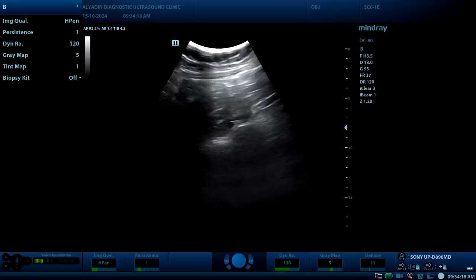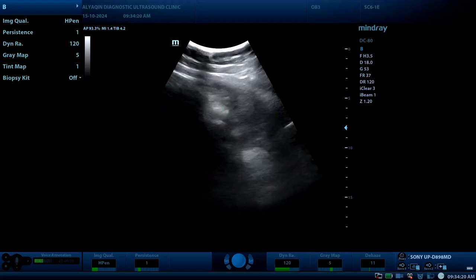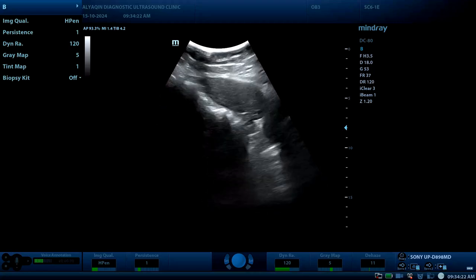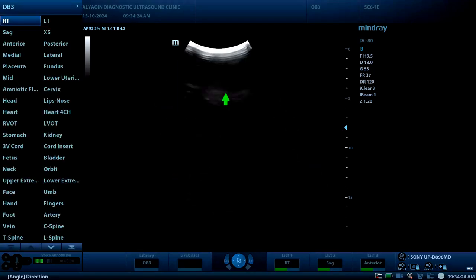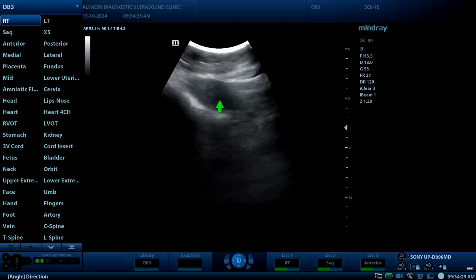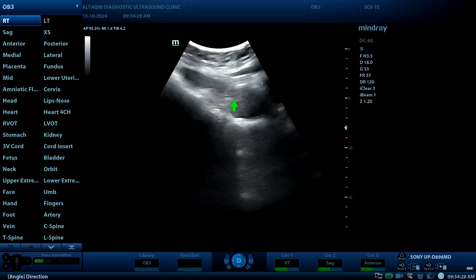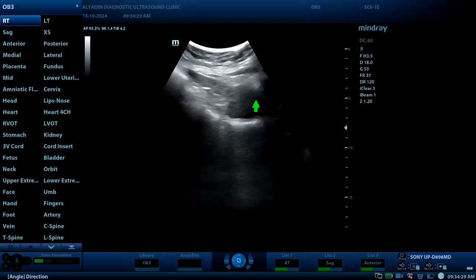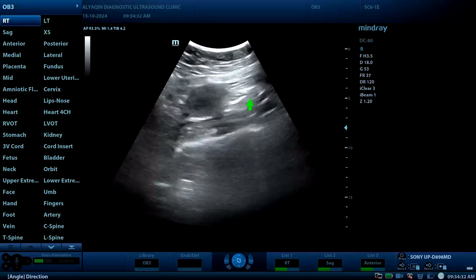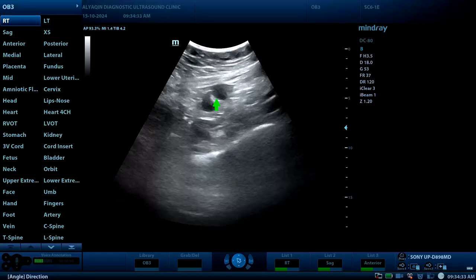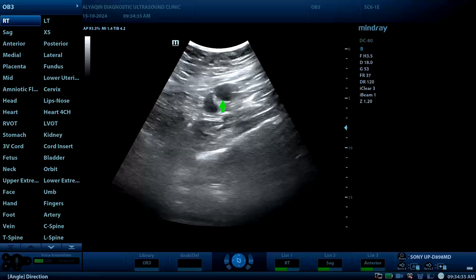There is enhancement — you can see. Moving to use the convex probe for more depth. Here is the uterus, this is the bladder, and this is the follicular left ovary.